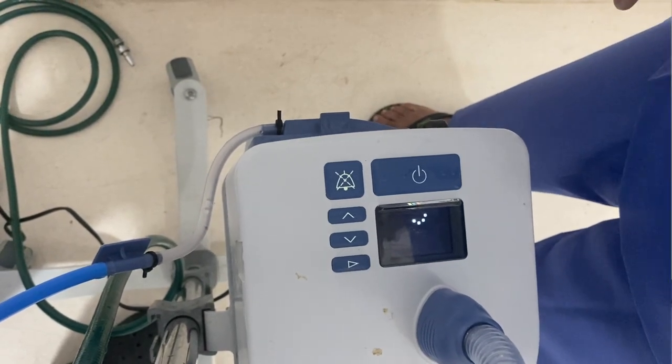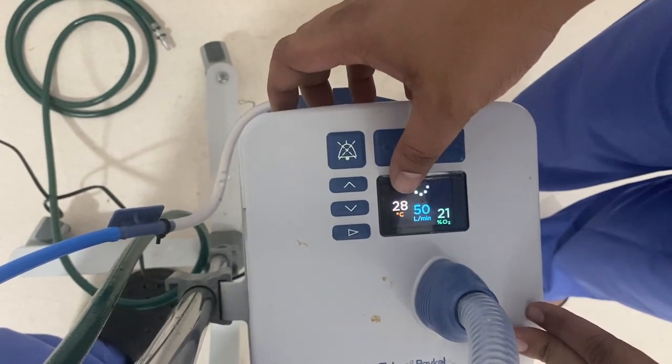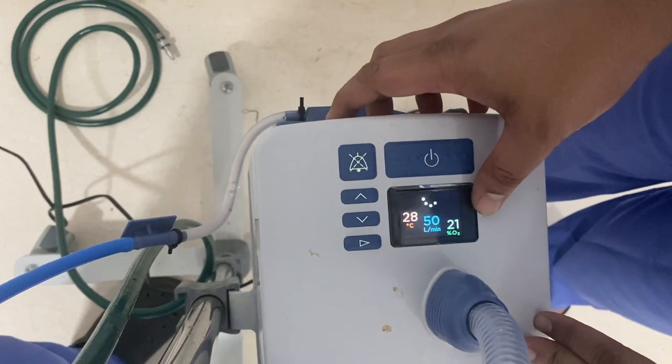If the machine has been properly disinfected, the green light below will glow — that means the machine is ready to use. Here we can see three parameters displayed: 28 degrees Celsius (the temperature), 50 liters per minute (the flow), and FiO2 at 21%.